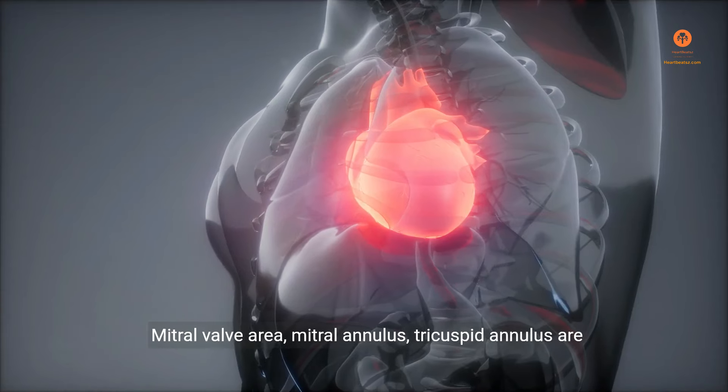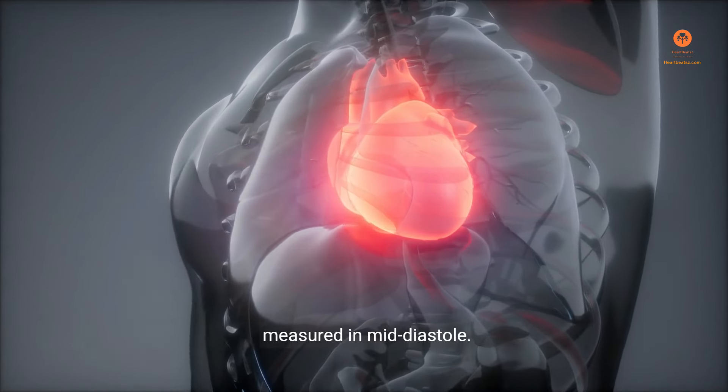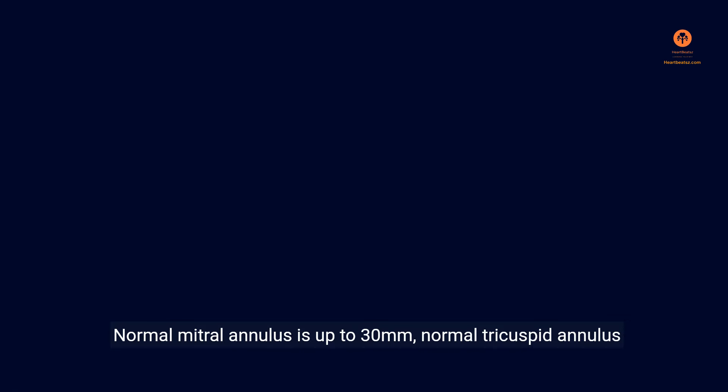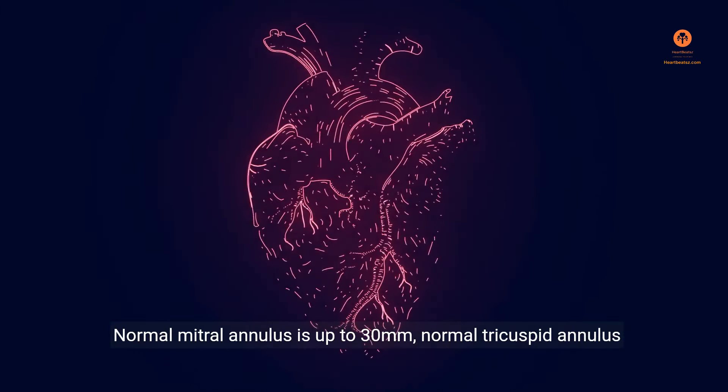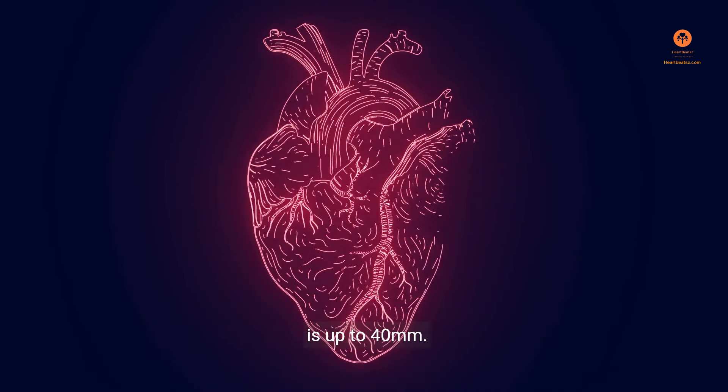Mitral valve area, mitral annulus, and tricuspid annulus are measured in mid-diastole. Normal mitral annulus is up to 30 mm. Normal tricuspid annulus is up to 40 mm.